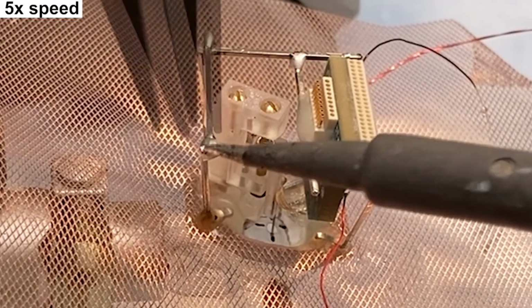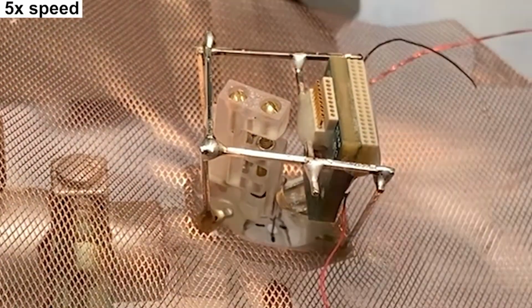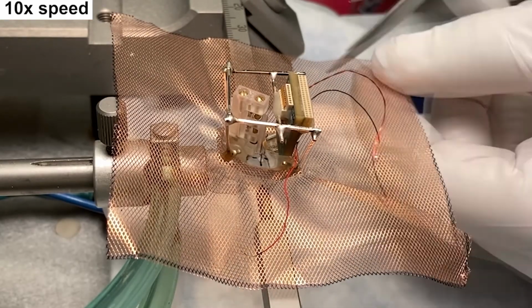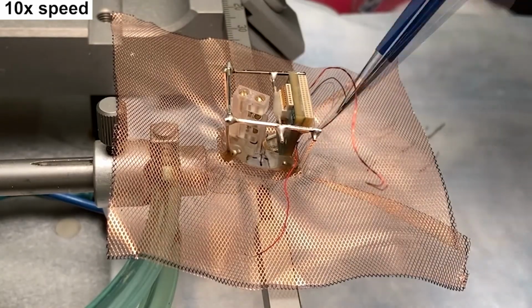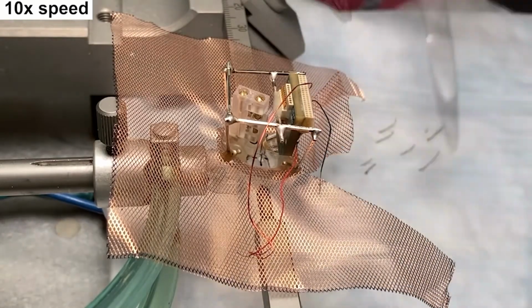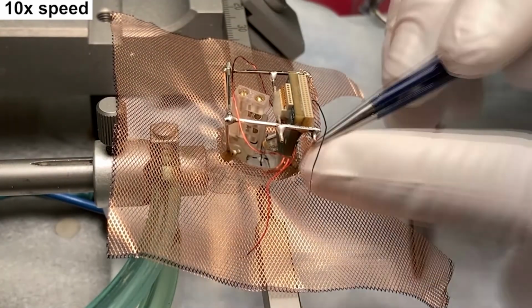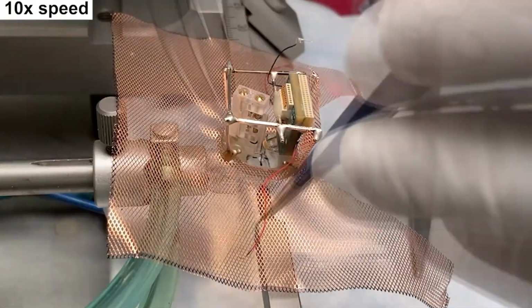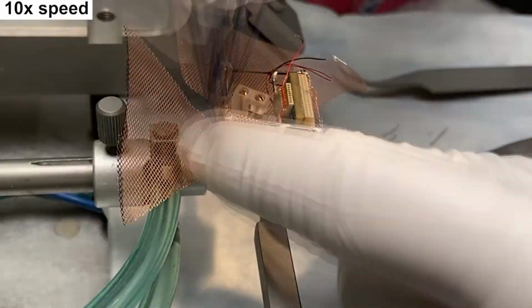Yes, and then once this is done, we can start folding up and cutting in the custom shape our copper mesh. So basically you just fold it up, you measure, you cut, and this gives you all the flexibility that you need during a surgery. So let me just skip through. And this is again just folding, cutting, folding, cutting.